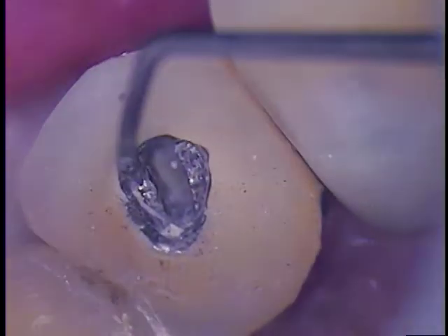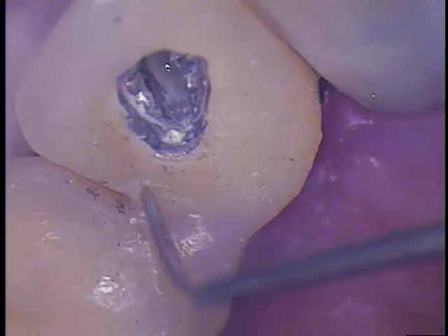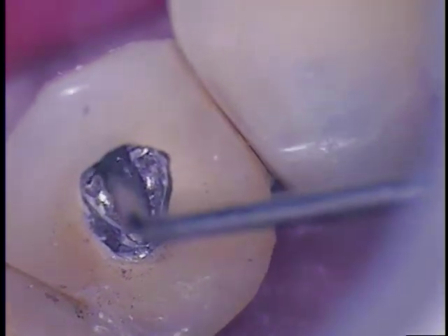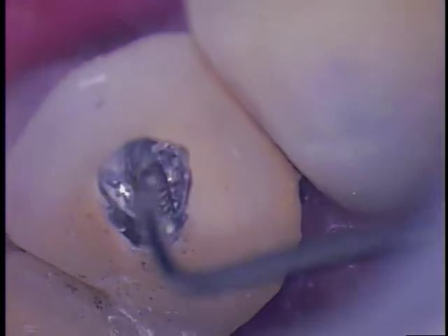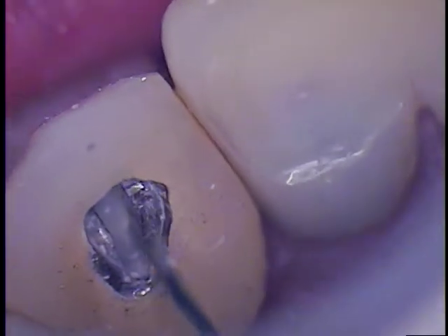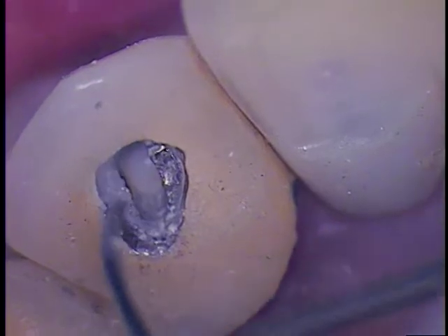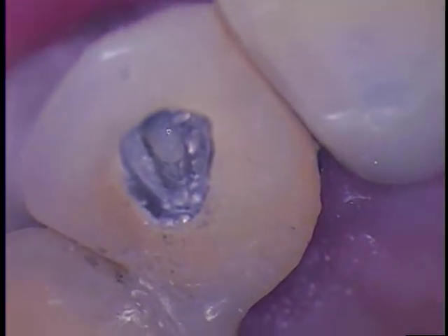If I can get the abutment loose from the crown, then I can take this off — this bonding agent, this composite — and pop the crown off. Then the rest is going to be pretty straightforward. We cut a little slot on the lingual, found the access hole and the associated cotton. I'm moving it so more of the material can penetrate up in and around there. We switched from tartar and stain to temporary cement remover, and we're finding it's really dissolving everything nicely. My assumption was correct — it definitely is temp-bond cement, without a doubt.